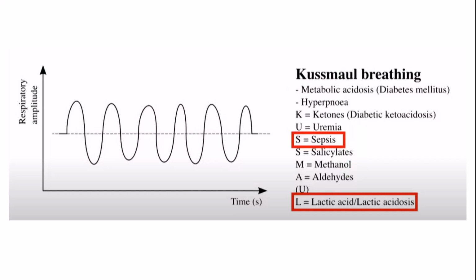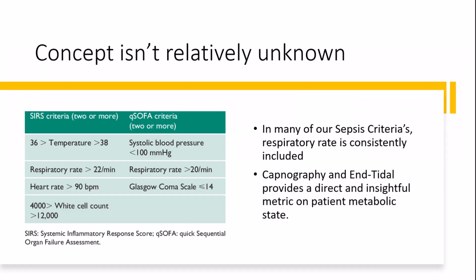So you can see a deeper inspiration and a deeper expiration. So kind of a rhythmic, deep in and out breathing pattern in these patients. And if they're not in DKA or suspected DKA, you need to think, could this potentially be a result of the infection?